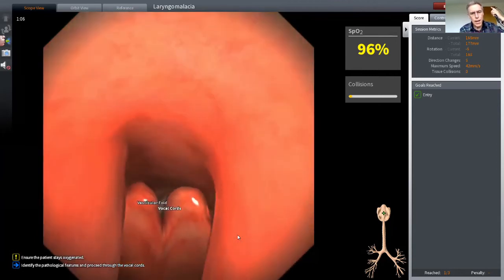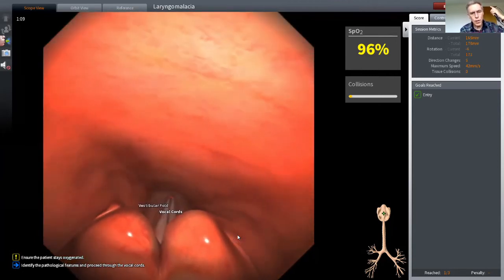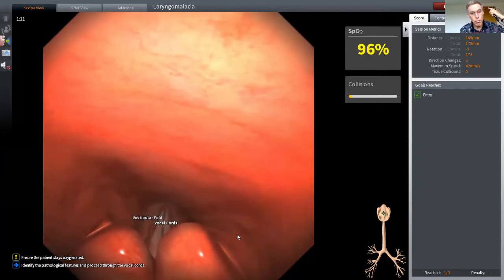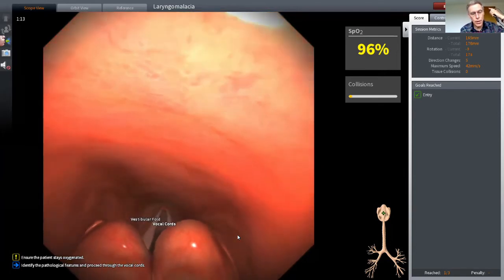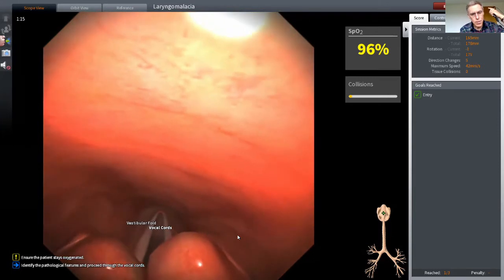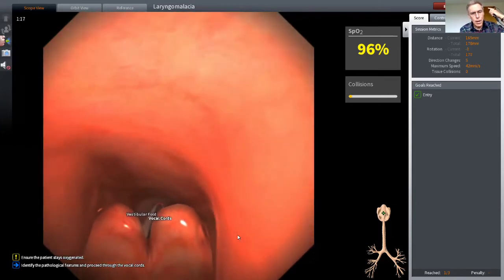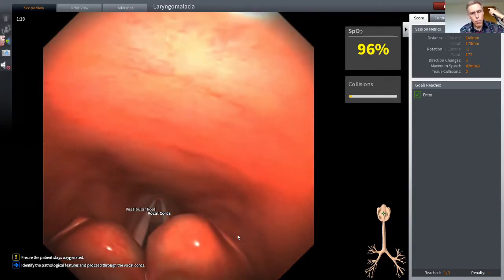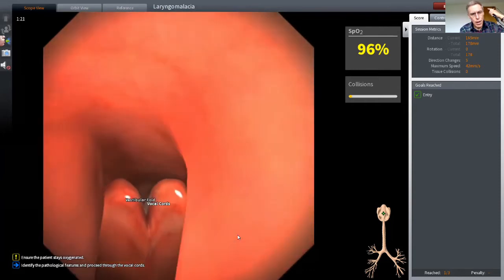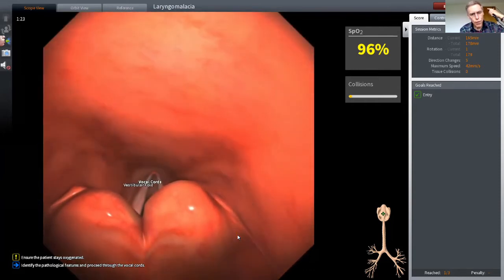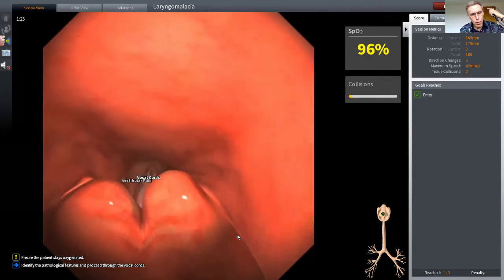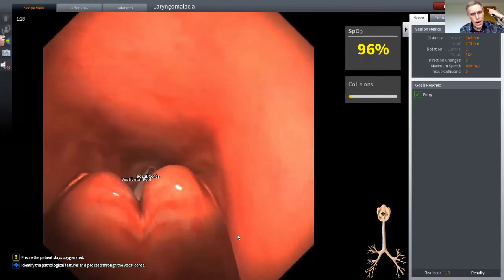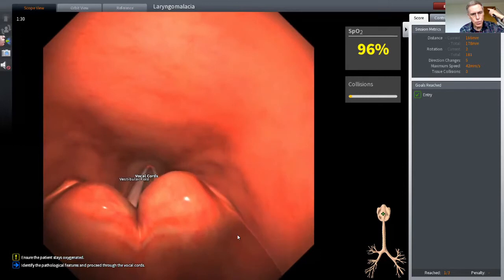Now, this baby has laryngomalacia. It's a very common condition seen in newborn babies, and it reflects immaturity of the larynx. It comes in three degrees of severity, but this is a type one that's the mildest of the three, and it's characterized by infolding of the aryepiglottic folds. You can see those arytenoids collapsing in towards the vocal cords with every breath.